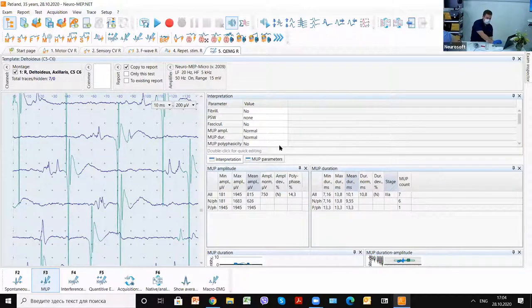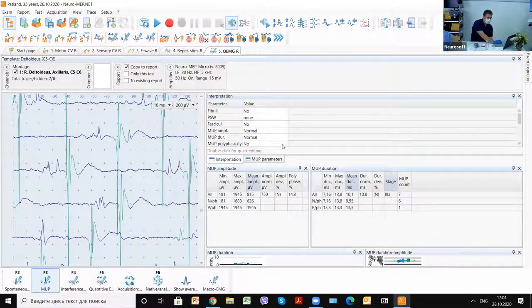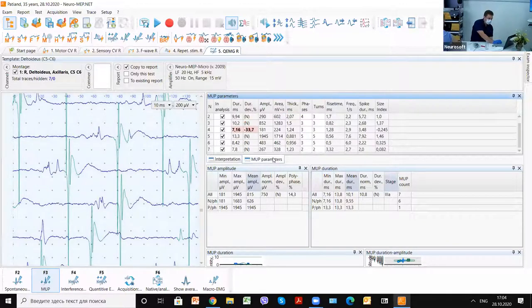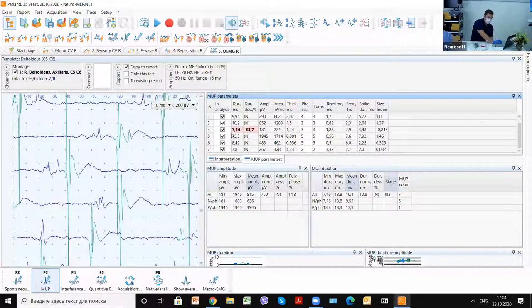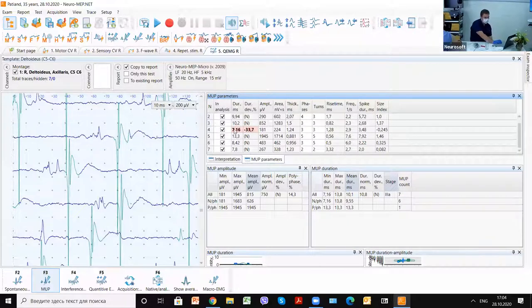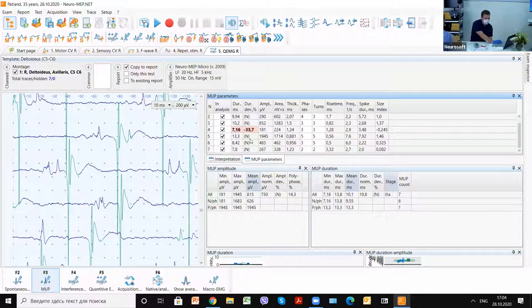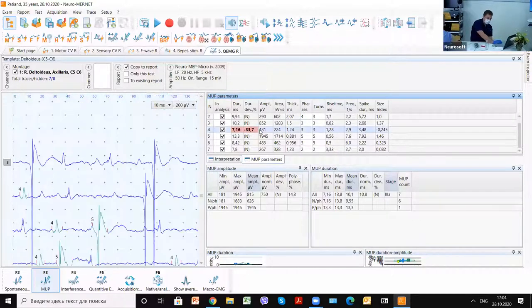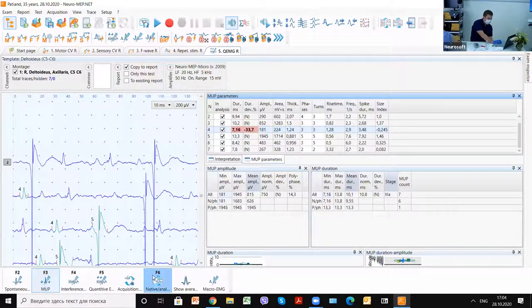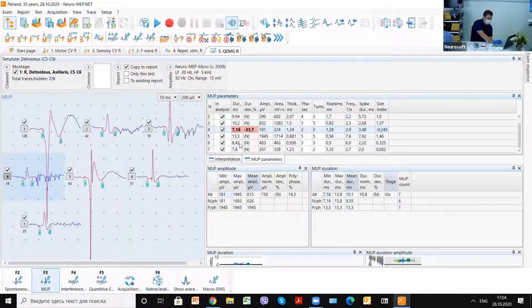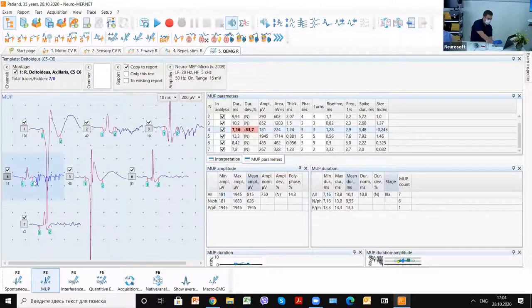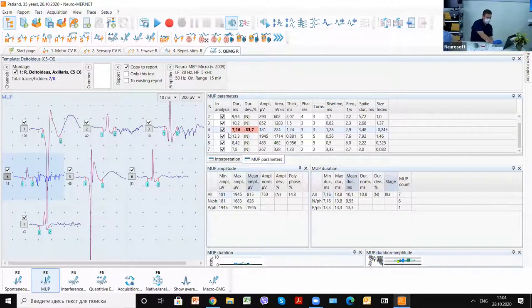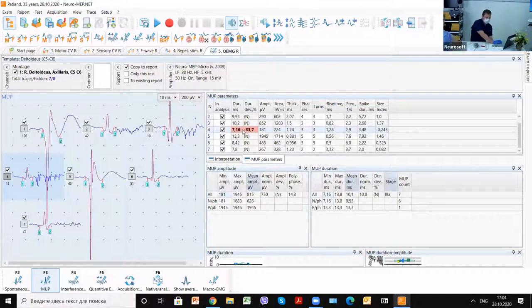We don't have any significant polyphases. It's okay, less than 15%. You can also check individual parameters of the motor unit potentials. And it's right. We can check, yes, it's a small potential with short duration.